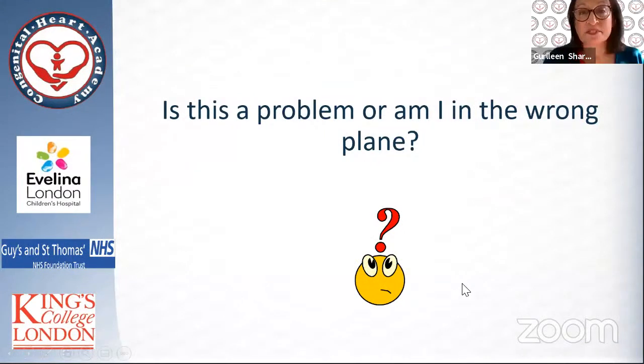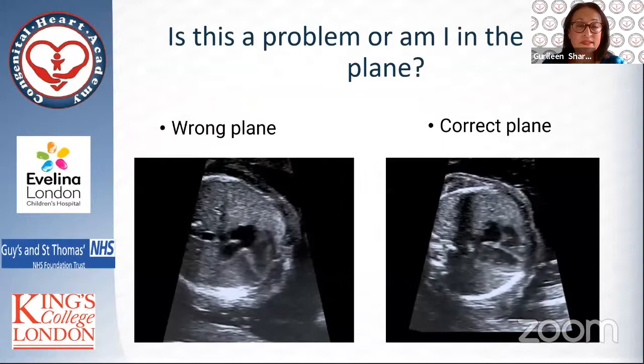For less experienced people, it is important that when you are assessing the fetal heart and making a diagnosis of a problem, that you're actually in the right plane for looking at whatever structure you're looking at. And I'm just going to show you an example.